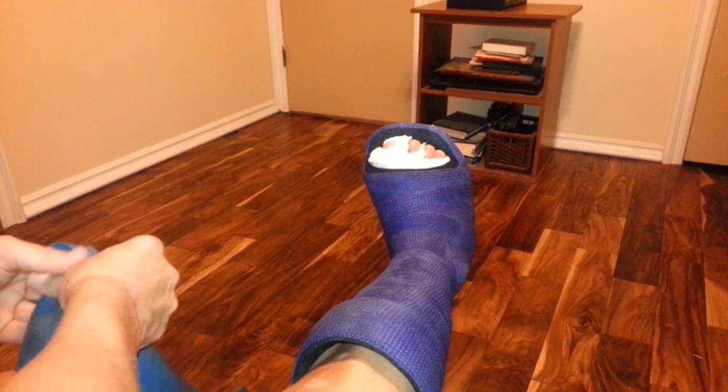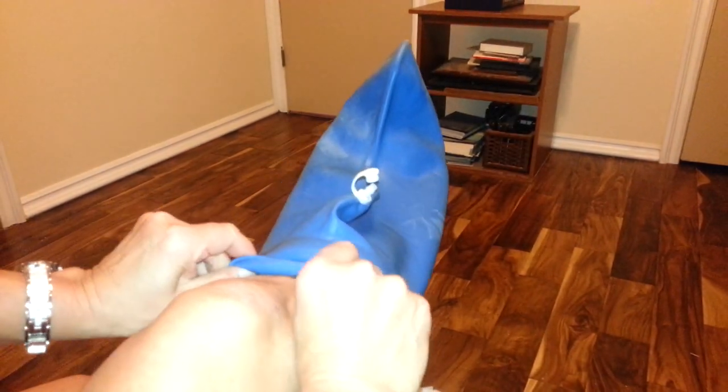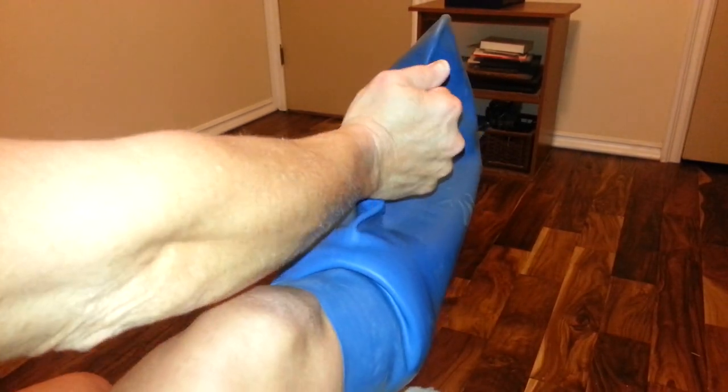It's very easy to put on, it's a hundred percent waterproof. You easily slip it on — it seems really big and floppy at first, but it's not, because there's this little valve here. You put this on top, which allows you to get all of the extra air out of the cast.